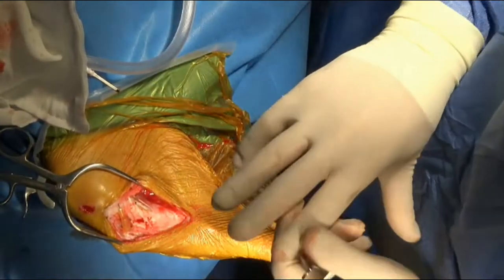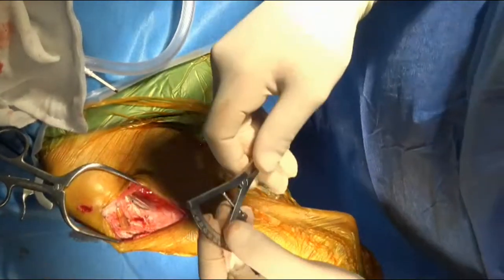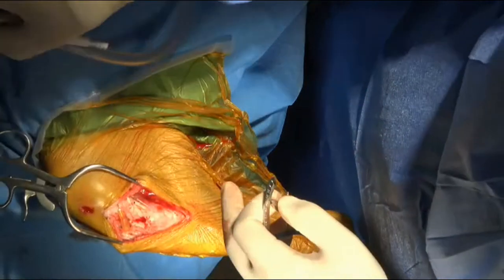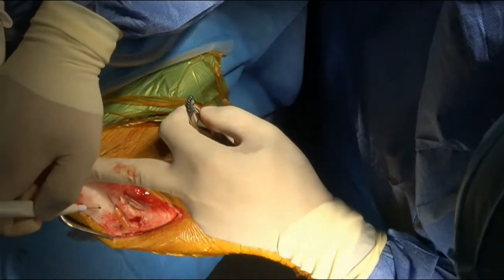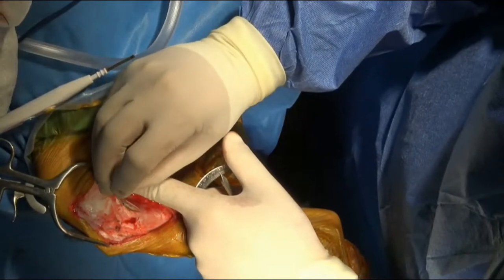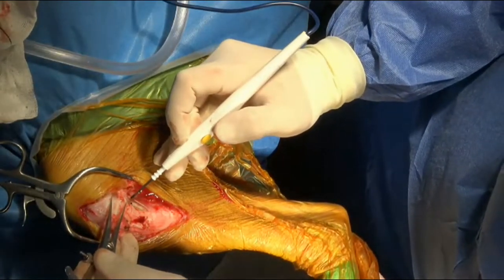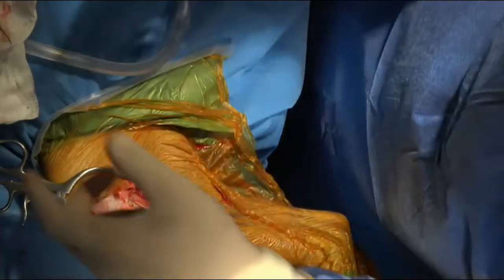So, next thing we'll need is the calipers. We've done a pretty detailed plan for this guy already, so I'm just going to work out roughly where my saw blade is going to sit on this leg. First measurement we had was from, I'll just continue that up here. Make our exposure a lot easier. I'm using this first needle to mark out where the joint is. Actually going to come a bit further caudal, just in front of the collateral ligament there. I'm going to mark out about 15 millimetres. So this is roughly where my saw is going to exit the bone in the caudal aspect.